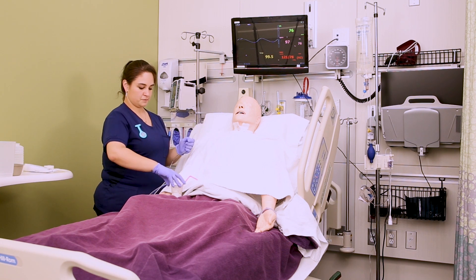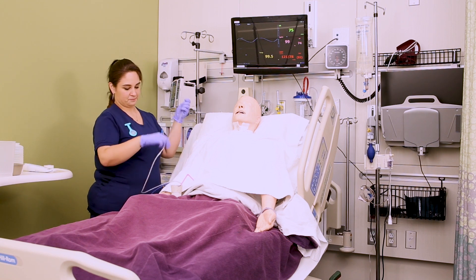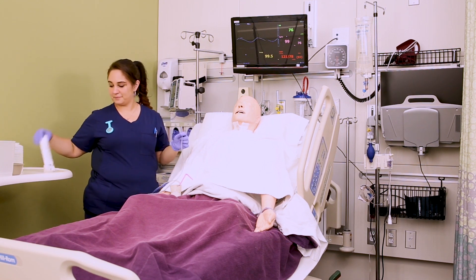Then give the patient a cup of water so they can sip and swallow while you insert the tube. Our big oversized Ken doll can't hold the cup, so just use your imagination here.